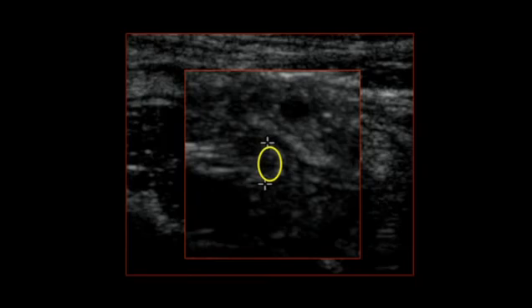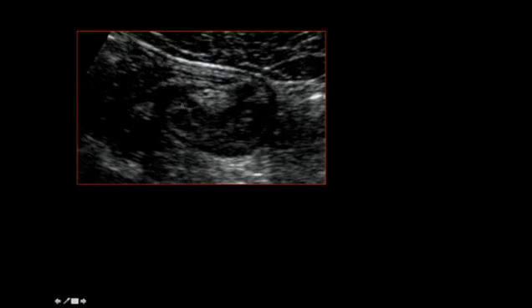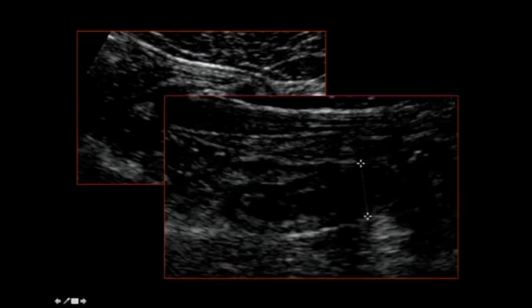It measures less than 6 millimeters under direct compression, and it's ovoid throughout its length, so we have reliably excluded appendicitis. In contrast to this patient, here we have the tip of the cecum. We have, on a separate image, identified the ileocecal valve, the origin of the appendix lacking that classic valve structure. The proximal appendix is normal, however, the mid and distal appendix measures more than 6 millimeters, in this case 9 millimeters, and if we were to scan this appendix in cross-section, it would be completely round.